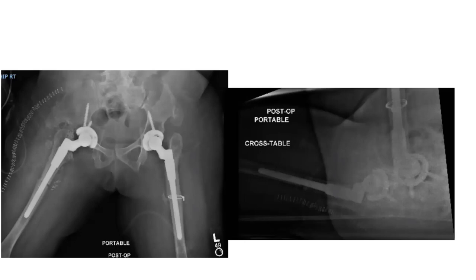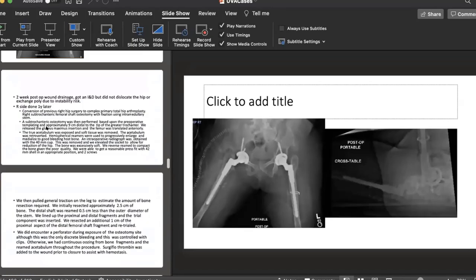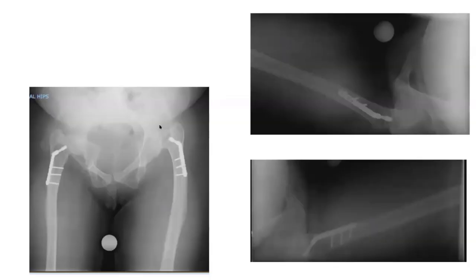Was that a prior osteotomy that was done before there? It was actually a subtroch shortening osteotomy. If you've got a bad dysplasia, I'll show you. So these are the pre-ops. This is like a Crowe 4, right? This is the native hip center, and this is where they are now.